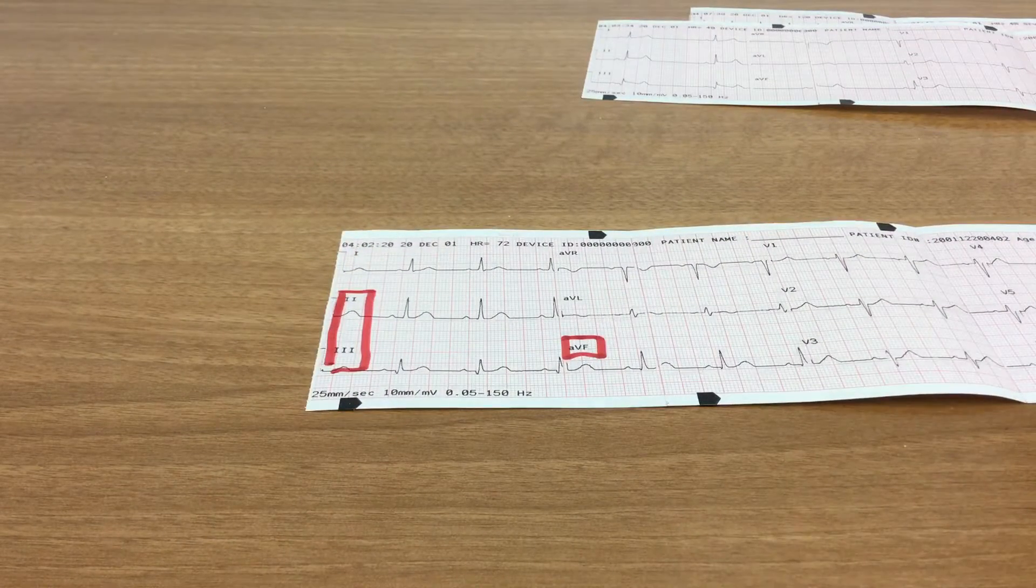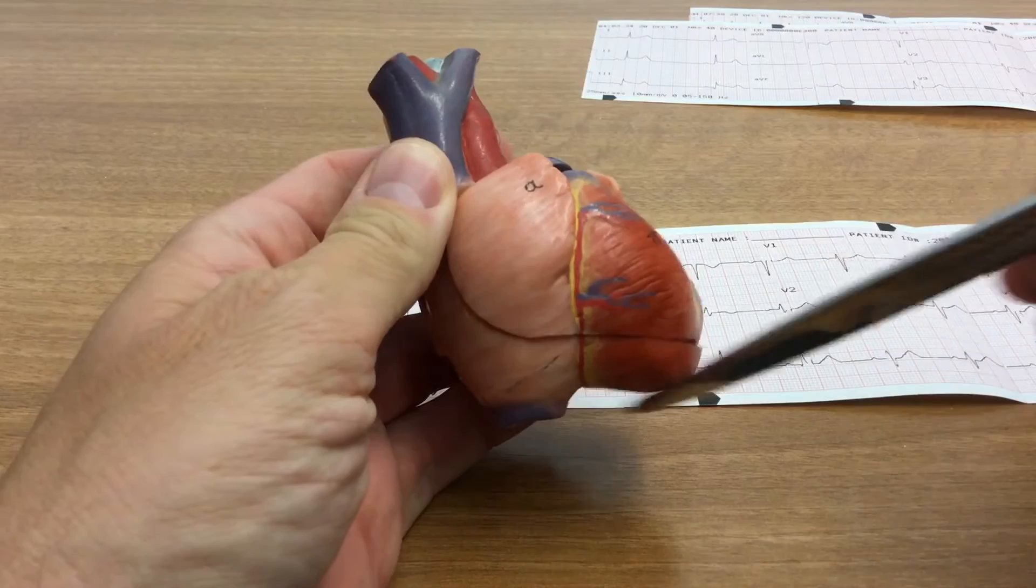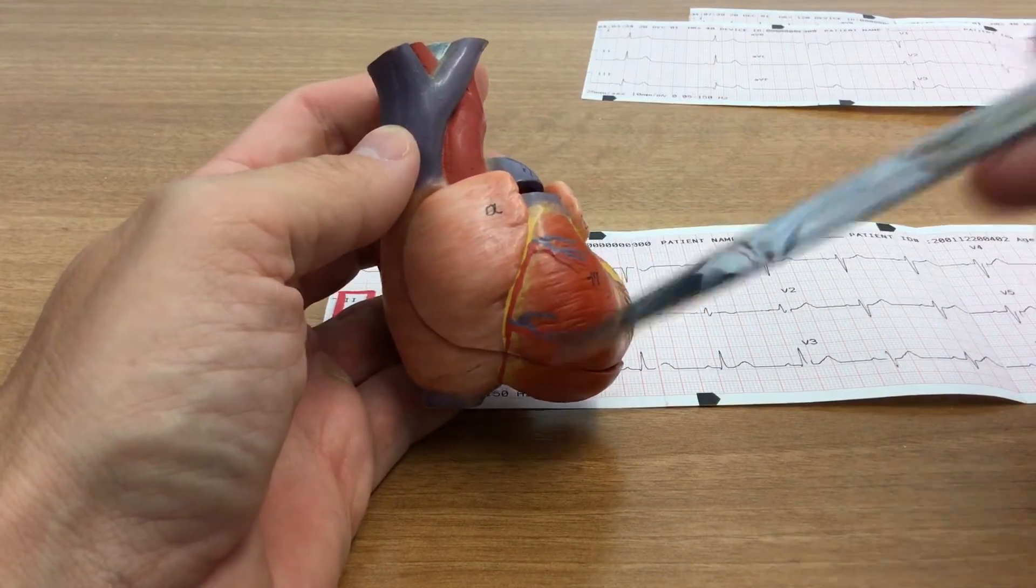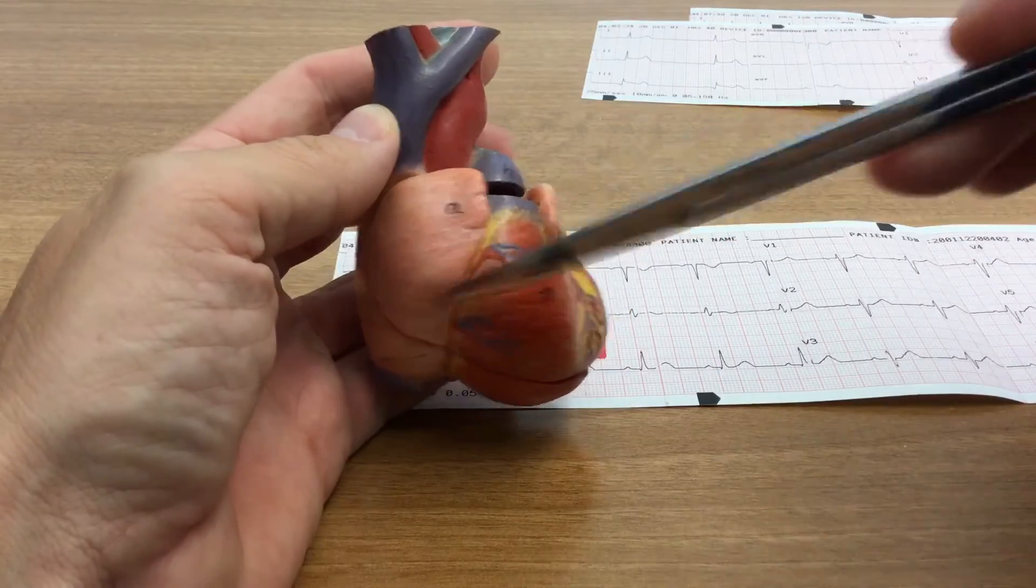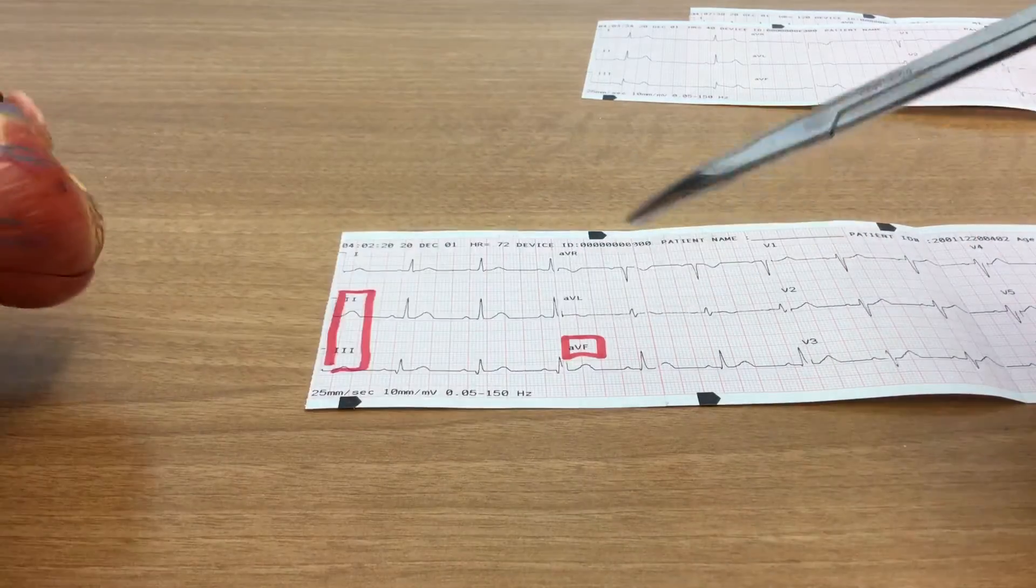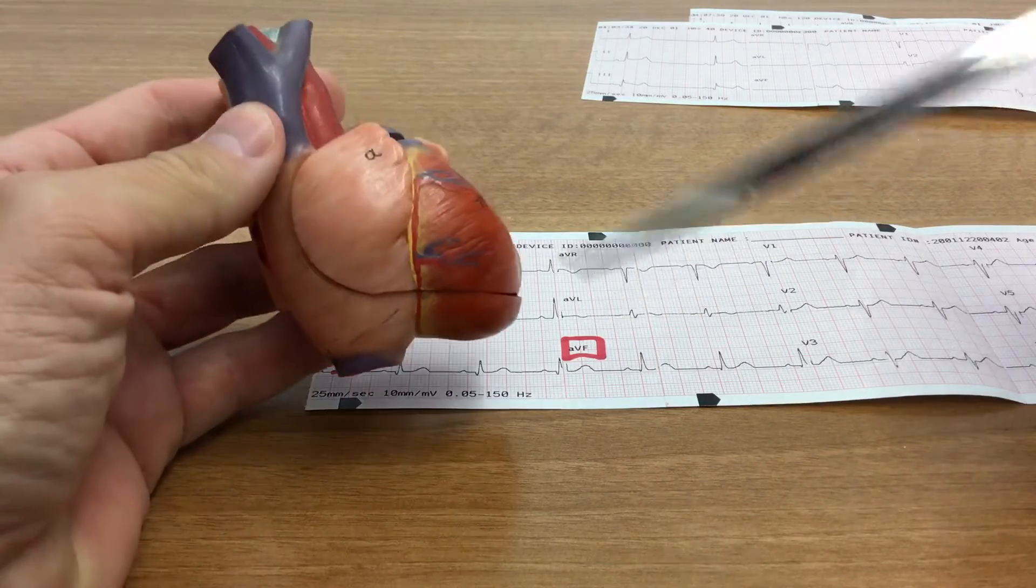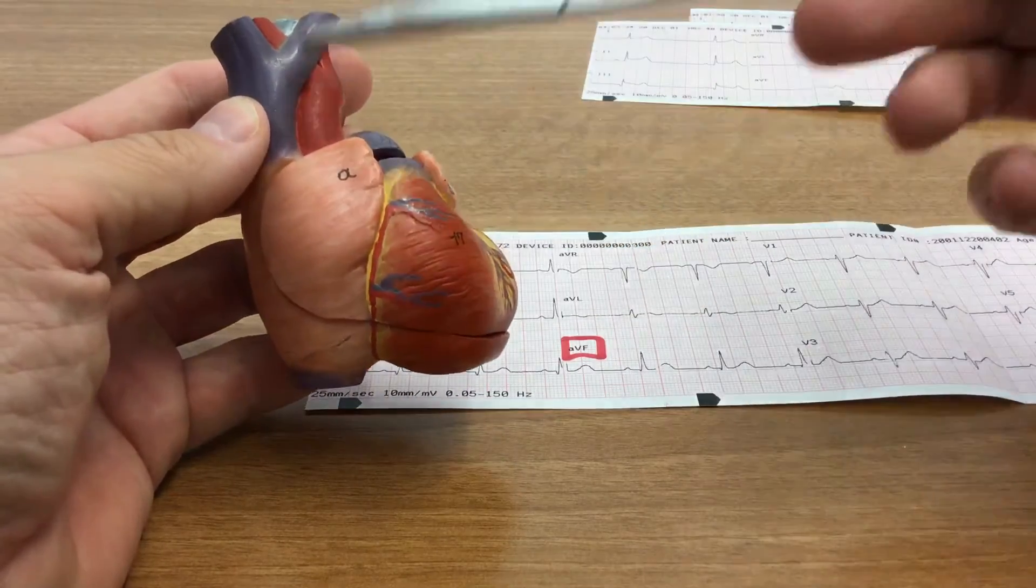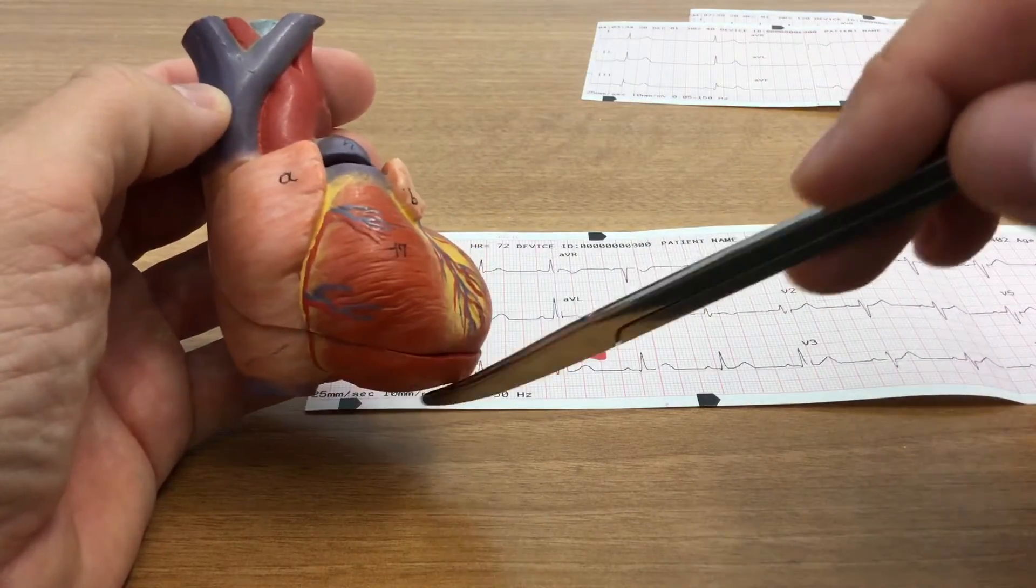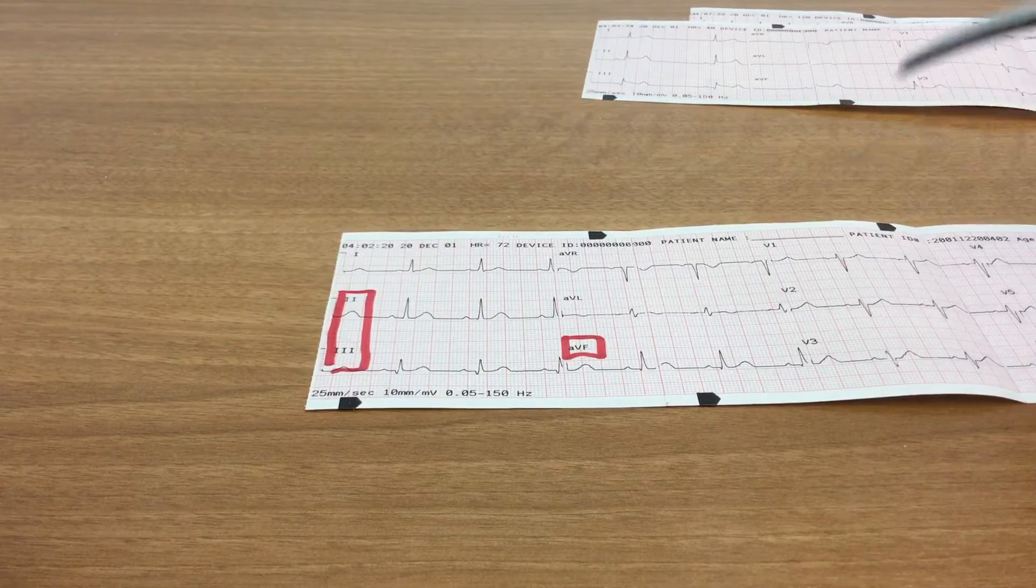So 2, 3, and AVF look primarily at the inferior wall of the left ventricle. And of course, that would also include the right ventricle to some extent, and the right atrium, right? So this whole area of the heart here is supplied by the right coronary artery. And it is this set of leads here, 2, 3, and AVF, that looks at this specific area of the heart, the SA node, the right atrium, the right ventricle, and the inferior wall of the left ventricle. So hopefully that makes sense. So far, so good.